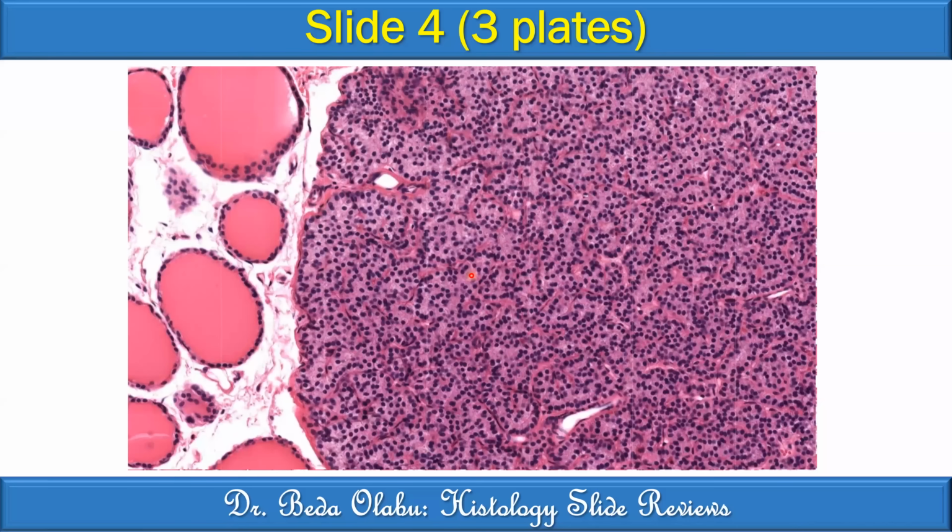Yeah, right from here, I can see that it has got a mixture of cells. Some are taking stains, while others are not. Next slide.